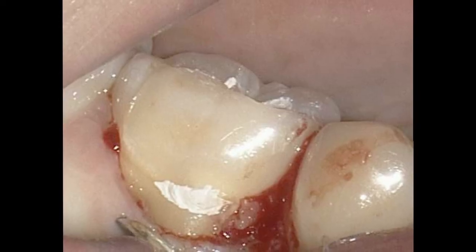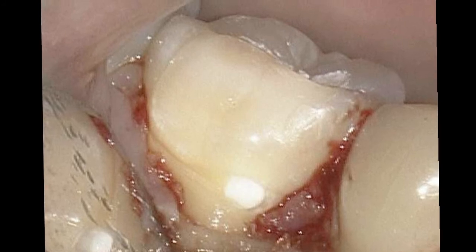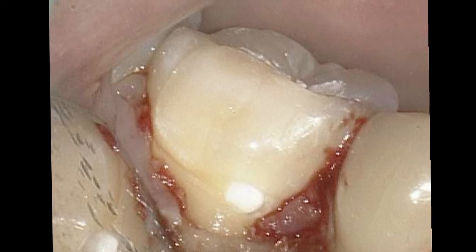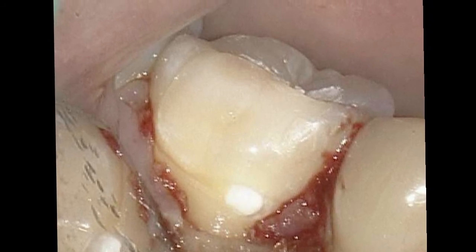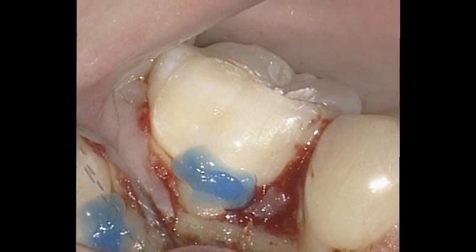A small full-thickness flap was then raised and the full filling and extent of the cervical perforation was assessed. The root repair material was completely removed until the opaque white composite placed through the access was obvious. The cavity surface margins were slightly beveled using an ultrasonic, and the entire cavity was etched with phosphoric acid, bonded with thin layers of composite, cured, and the surface was then polished.